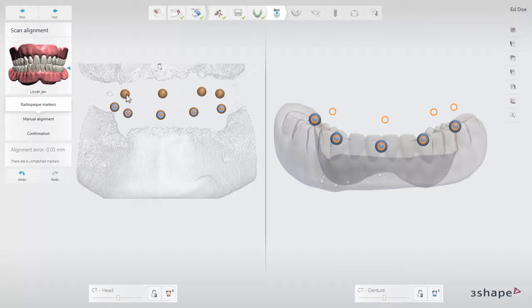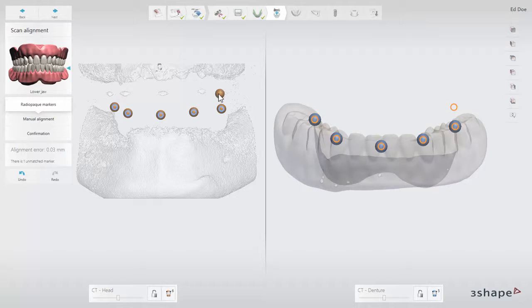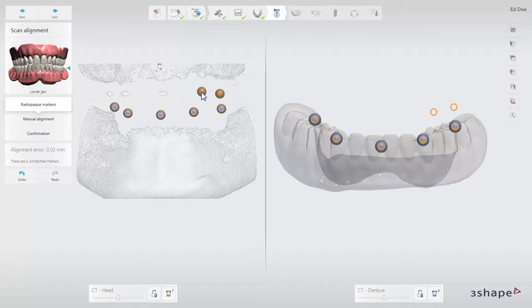To correct the defined markers, you can remove a marker or place a new one. Simply left click on any marker to turn it off and you will see that it is removed. Simply click again or on any unidentified marker to turn it on and you will see it appear. A circle on the one scan shows the position of a corresponding marker on the other scan.